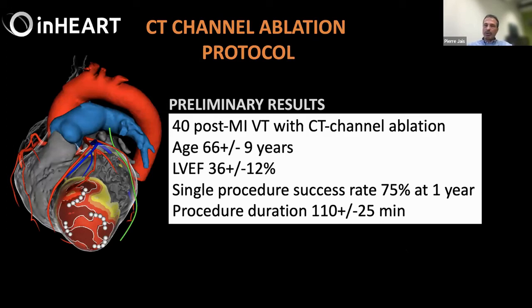You pretty much know that your VT ablation case is going to last 2 hours. And so from a planification and efficiency and lab time, these are things that a hospital director can understand. It means that you can have an extra pulmonary vein isolation, whatever procedure. And so from a cost issue, it probably makes sense.